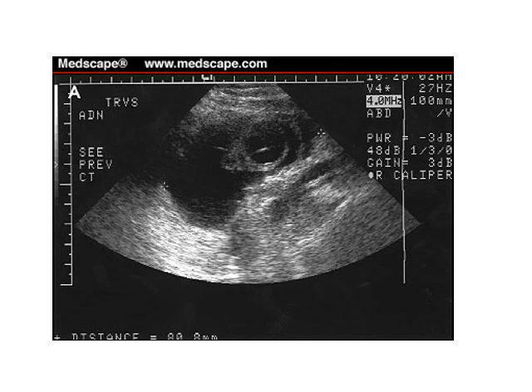So I can squeeze those two things up. It's going to be on the first page. Okay. So we're going to take a peek at this. This is a transverse image, all right? So it's transverse here. So I said you're going to see some type of short form for transverse.